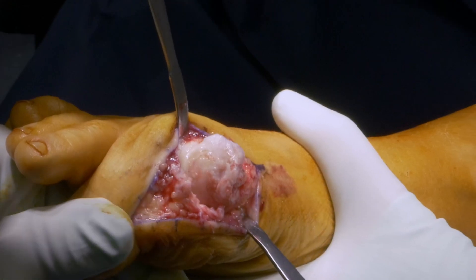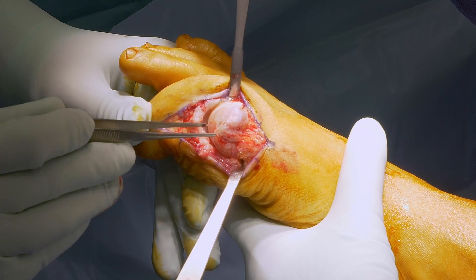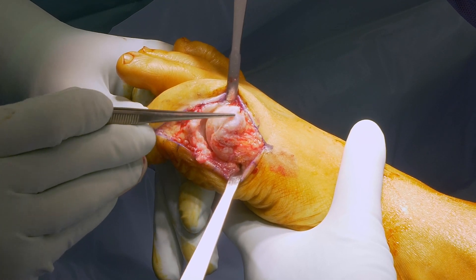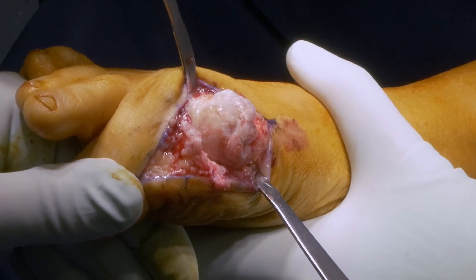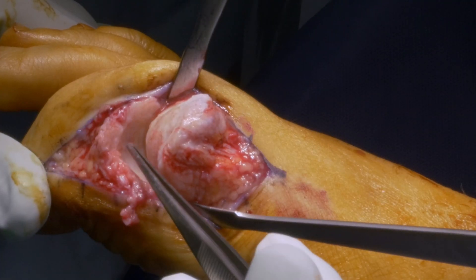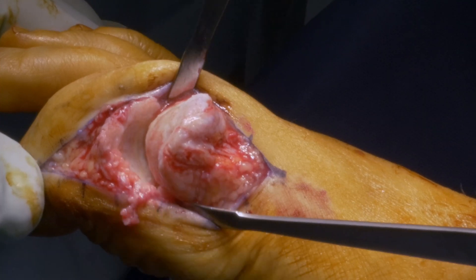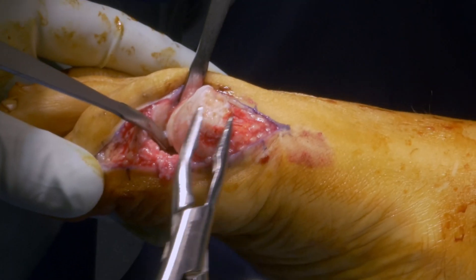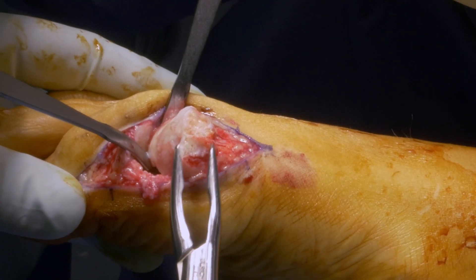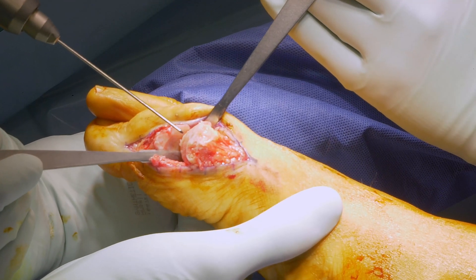Please see here the severe grade 4 osteoarthritis and surrounding osteophytes of the head area. Also on the phalangeal side, the degenerated joint and osteophytes can be seen. In the next step, those osteophytes are removed to prepare the reaming of the metatarsal head.